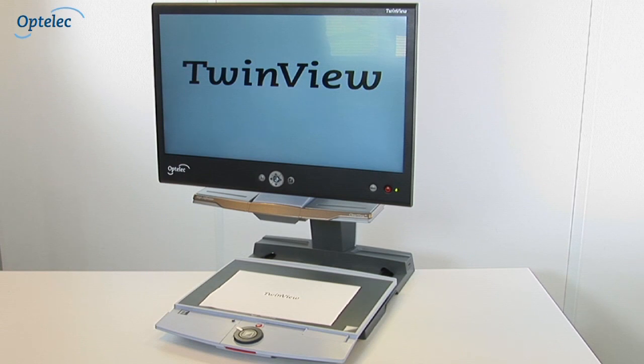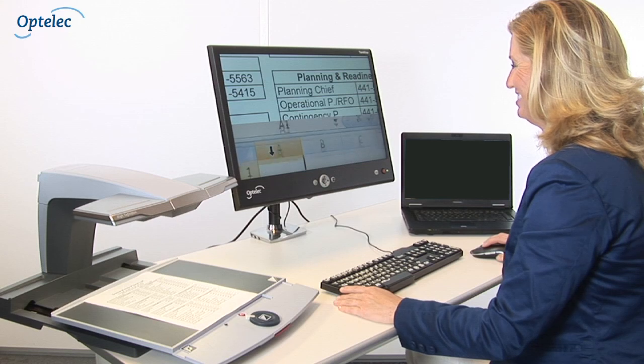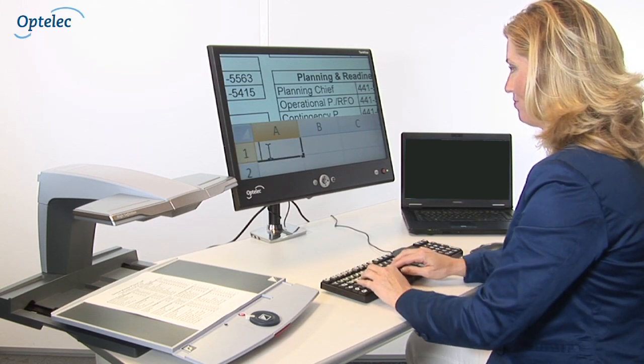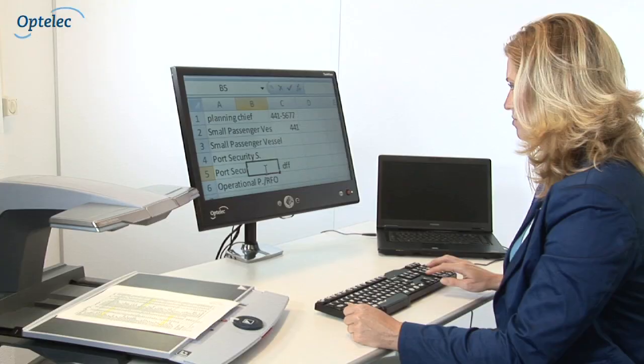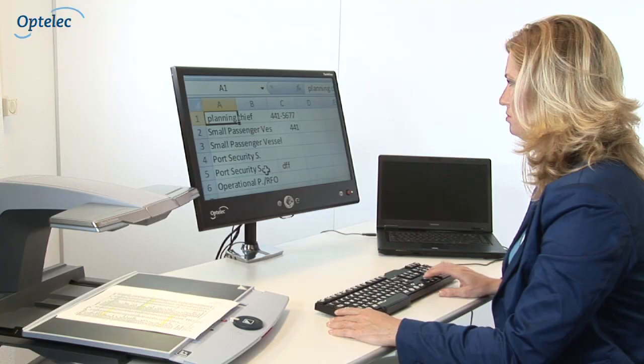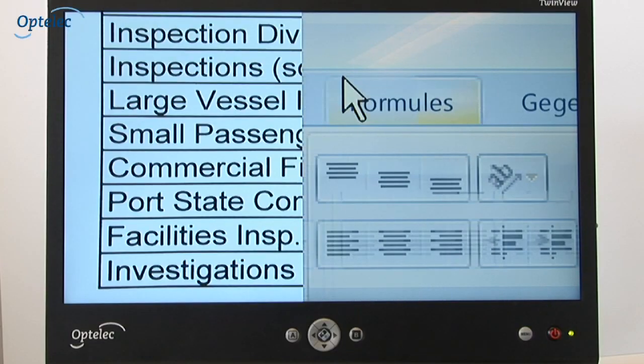Alternatively, you can also mount the TwinView to a proprietary monitor arm for increased versatility and use in close proximity to the computer keyboard and mouse. However you choose to configure your workstation, you can always connect the Optelec ClearView Plus and the computer to the TwinView and work with both simultaneously.